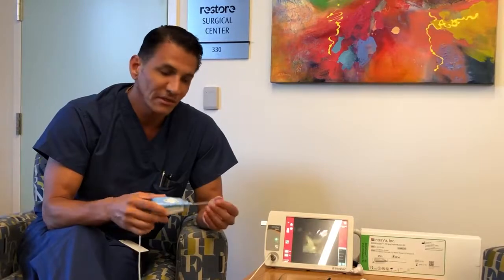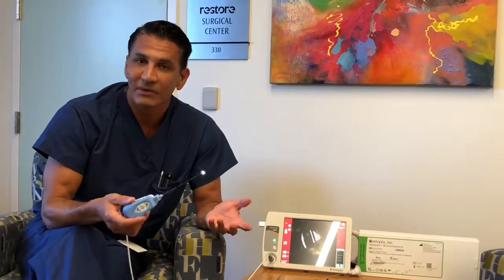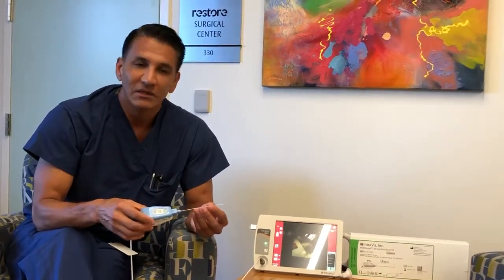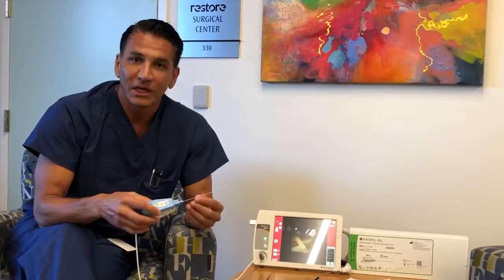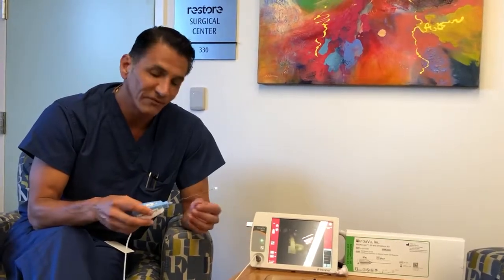Other reasons that I find it useful for, the obvious is a patient that can't have an MRI. They have maybe a defibrillator and they can't have an MRI, and they have meniscus or cartilage type of symptoms, and you just want to double check. Put it in there, take a look. There's not much else you can do other than a CT arthrogram, which I really don't find that useful. So that's the other subset of patients that it's good for.